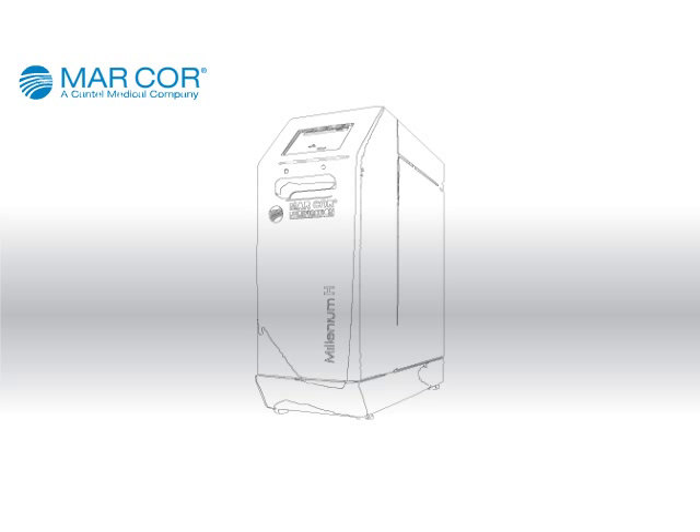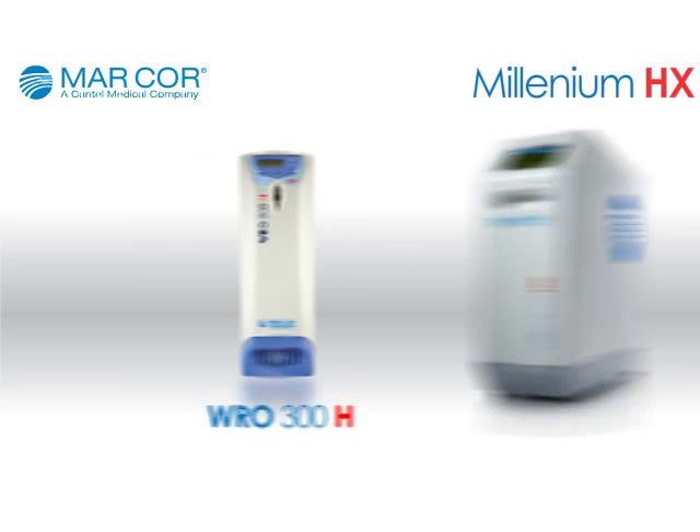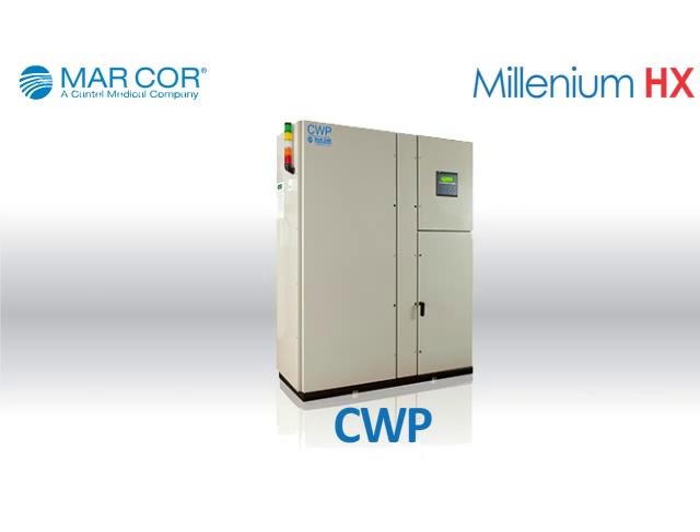Meet the next evolution of portable reverse osmosis devices for hemodialysis, the Millennium HX, all part of MarCore Purification's latest design in our increasingly diverse line of dialysis water treatment solutions.